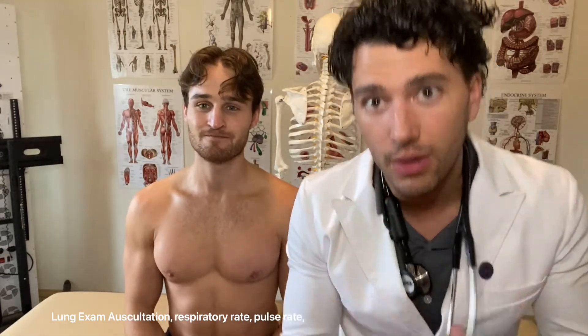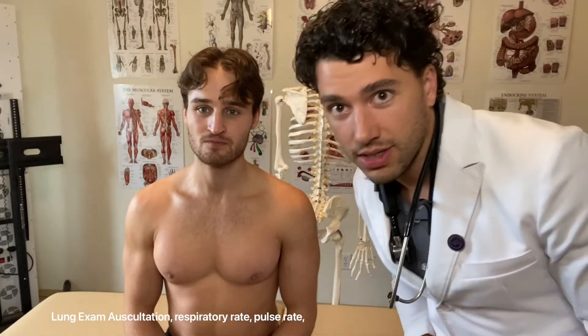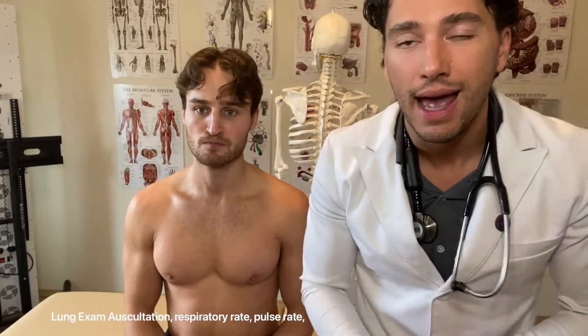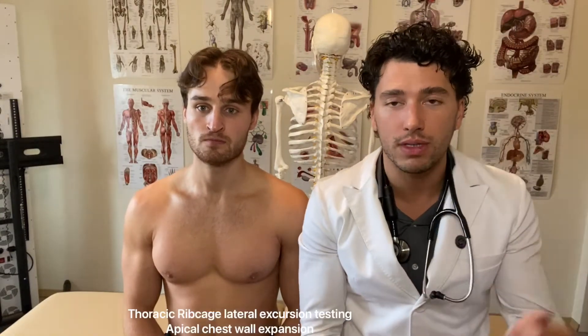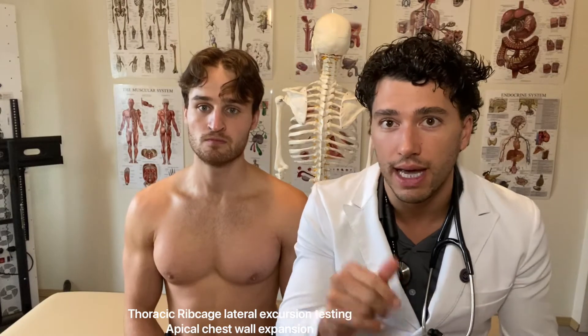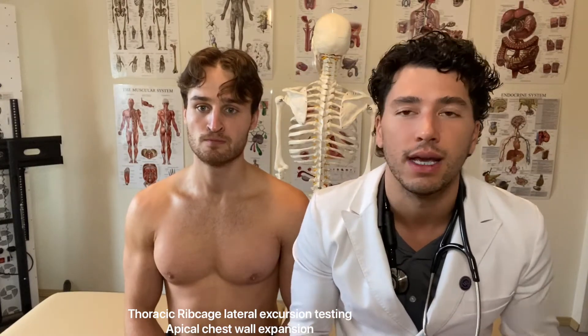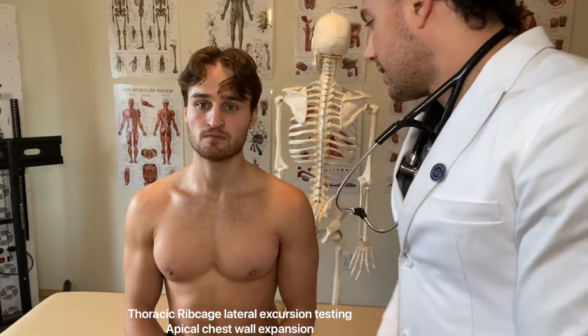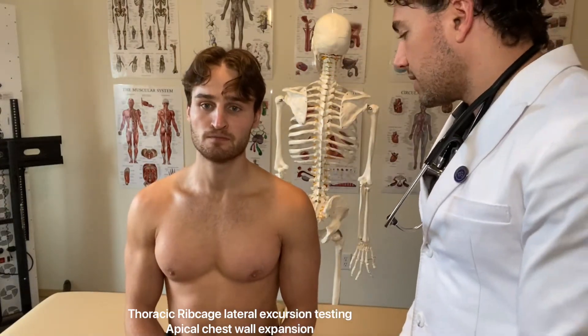First, what we're going to do is general observation of the breathing. I'm going to ask you to take a couple of breaths in and out. As I observe, I'm going to check his respiratory rate — a general guesstimate of around how many breaths per minute, typically around 12 to 14, is what you're going to get from your doctor. I'm also looking at the rib movement.